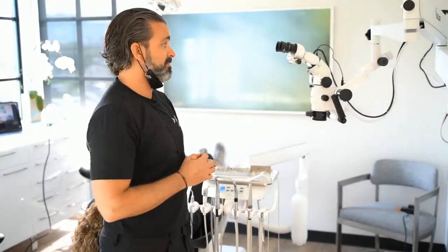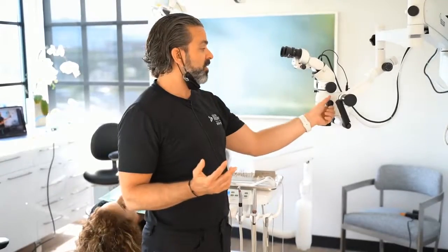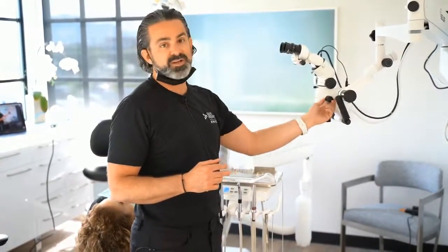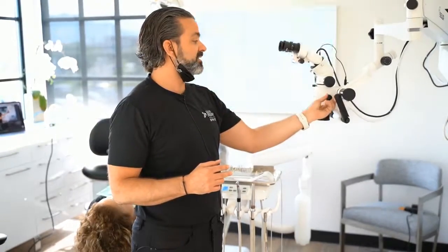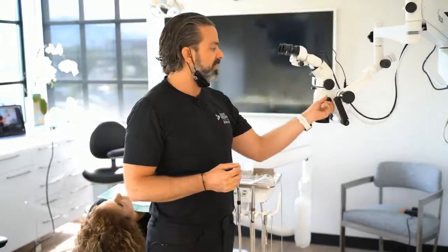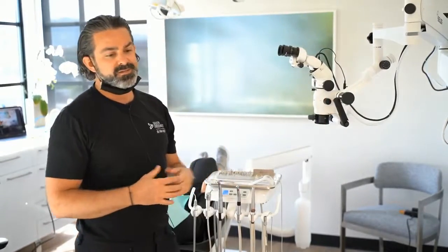Some really like the math game and will tell you the magnification factors that are going on. I don't really care about that. But I have a 1 through 6 step, which is very easy. I usually work at 3. As an endodontist, I'll access and anesthetize at a 2.